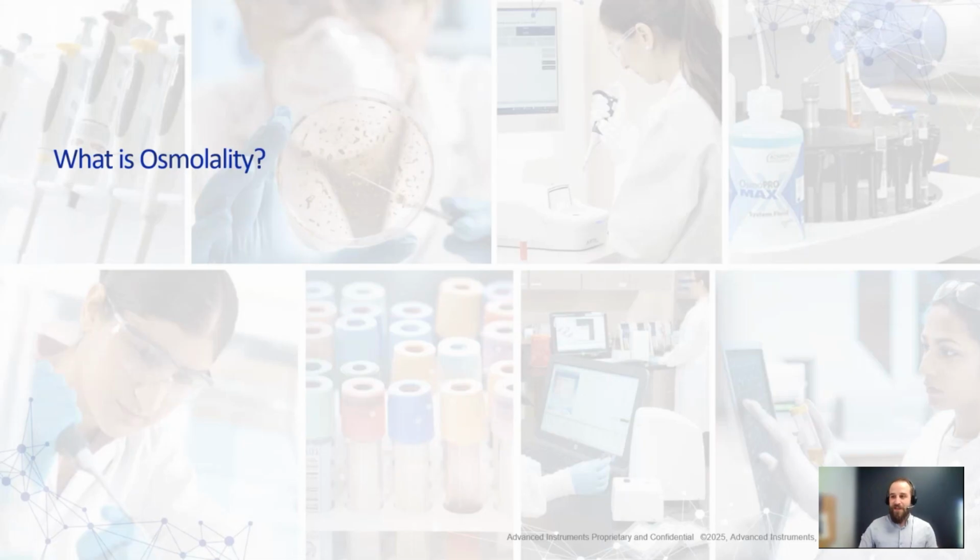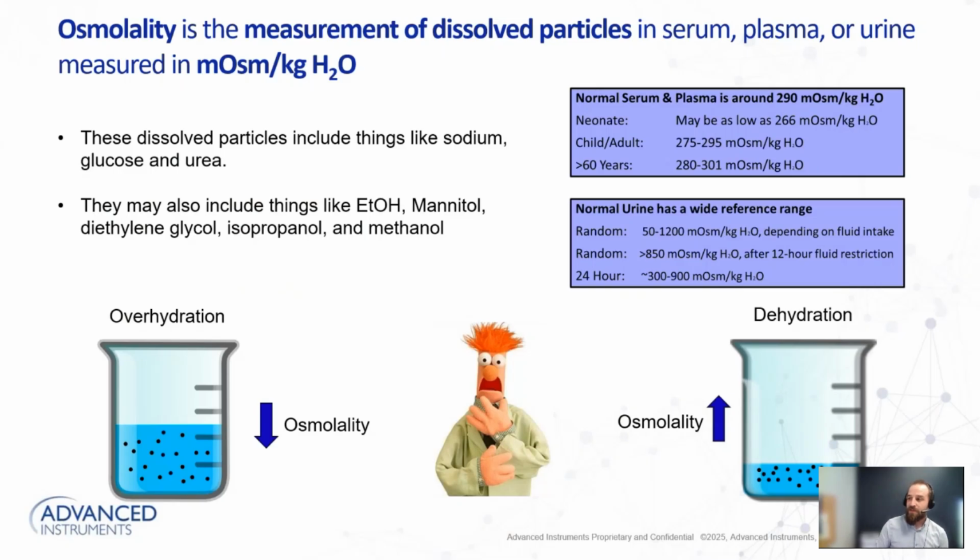So what is osmolality? Osmolality is the measurement of dissolved particles in serum, plasma, or urine. Some folks like to measure some other body fluids as well, but what we're going to be focused on today is serum, plasma, and urine, and it's measured in milliosmoles per kilogram of water. So it's really the concentration of dissolved solids relative to the volume of water in the sample or in the patient. These dissolved particles can include things like sodium, glucose, and urea.